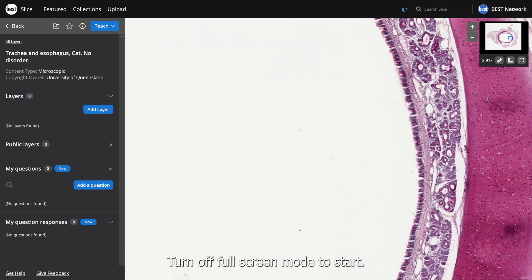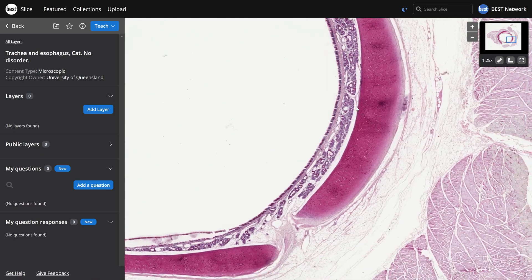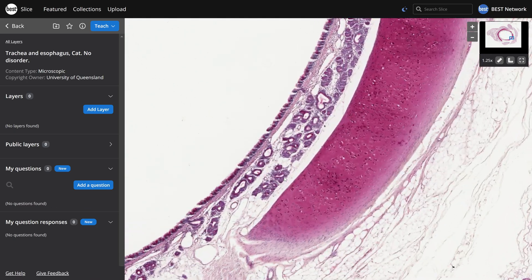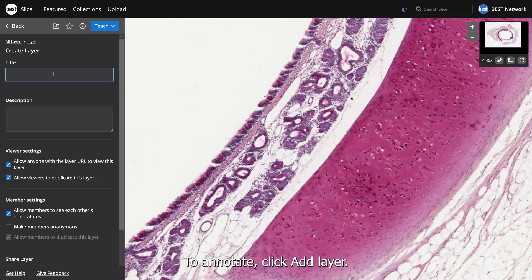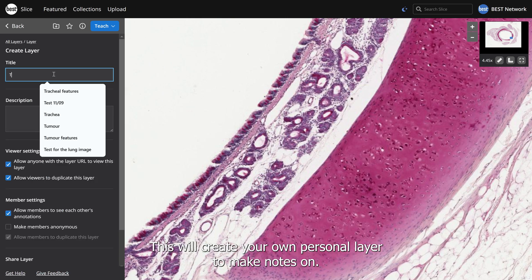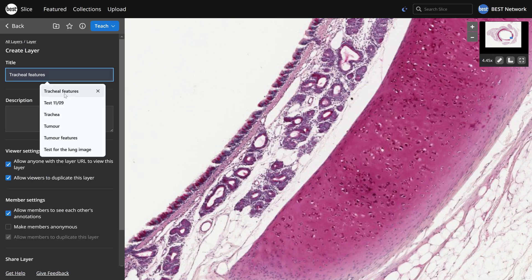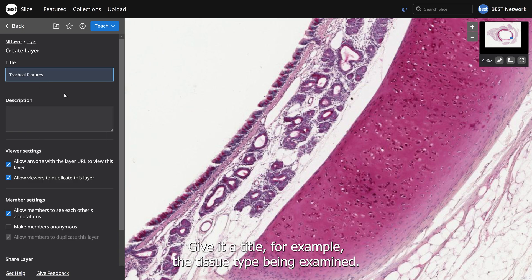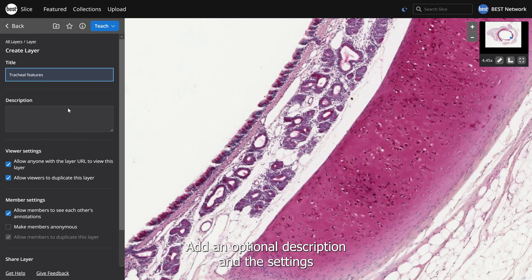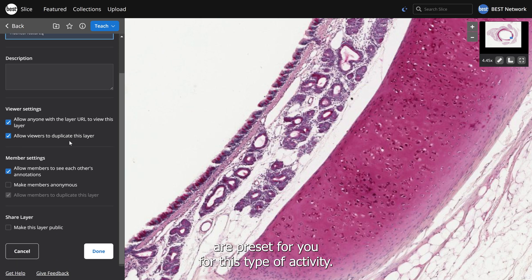Turn off full screen mode to start. To annotate, click Add Layer. This will create your own personal layer to make notes on. Give it a title — for example, the tissue type being examined. Add an optional description; the settings are pre-set for you for this type of activity. Click Done.